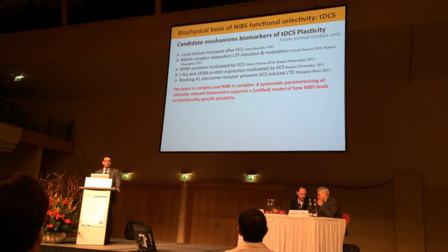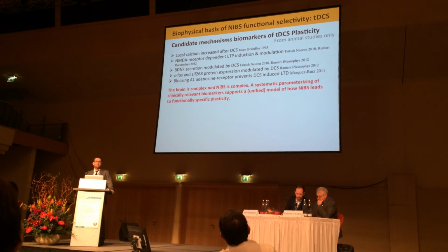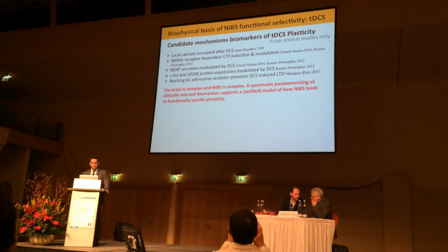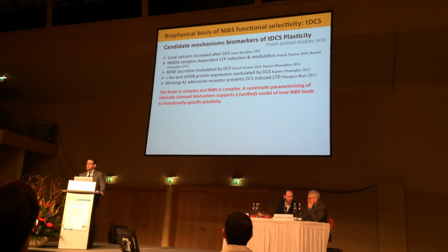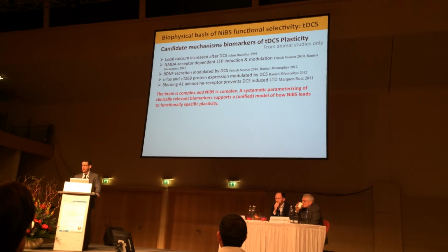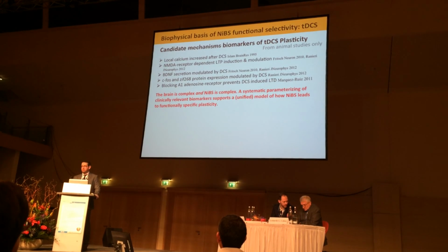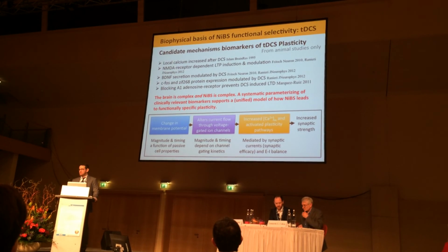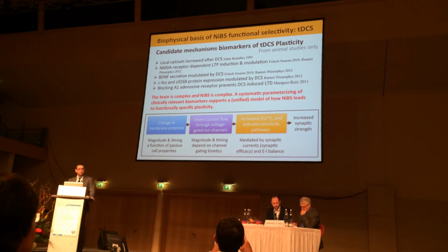I think non-invasive brain stimulation is also rather complex. So if we want to be a bit realistic, maybe humble, and say we would like to make this translational jump within the next few years, not in the next 100 years, maybe the approach is a little bit different. Rather than just trying to characterize every possible mechanism, what we need to fish out are the biomarkers, the things that predict what tDCS will do. And we need to identify how those biomarkers respond to stimulation, tDCS or TMS, in a way that is hopefully translatable. I certainly don't want to diminish the importance of mechanism, the importance of drilling down at these levels, but I think at some point we have to come back to this higher level conception.